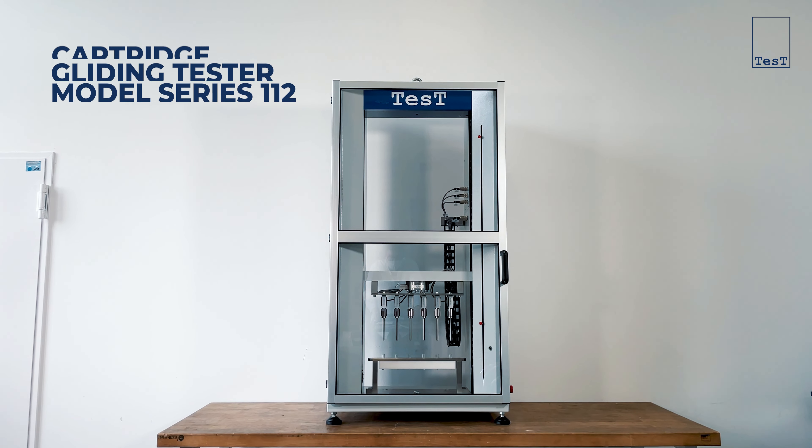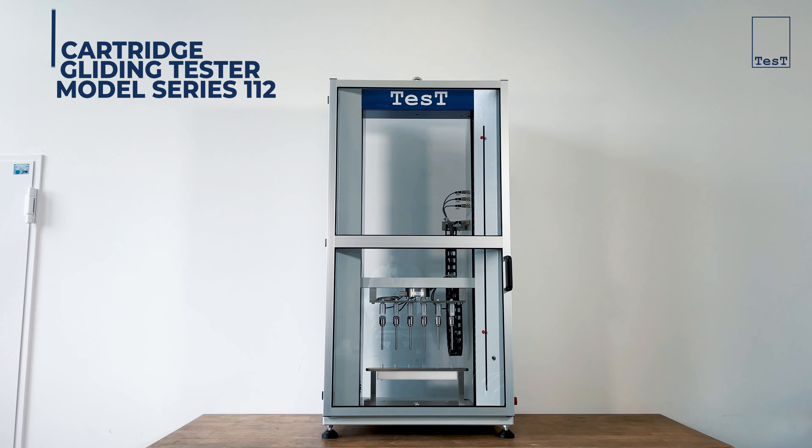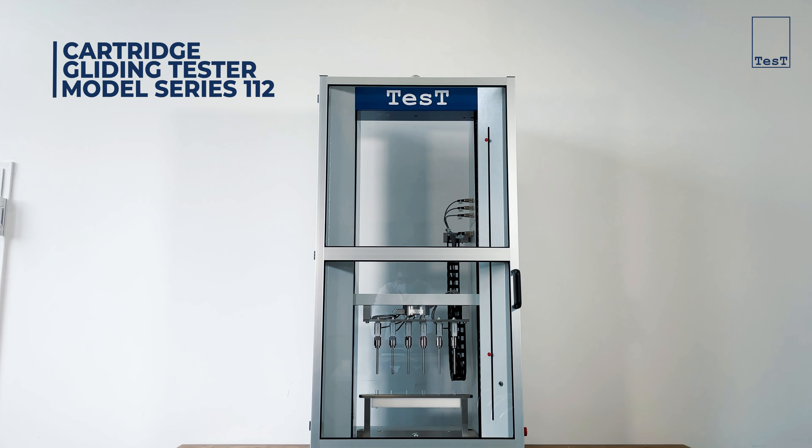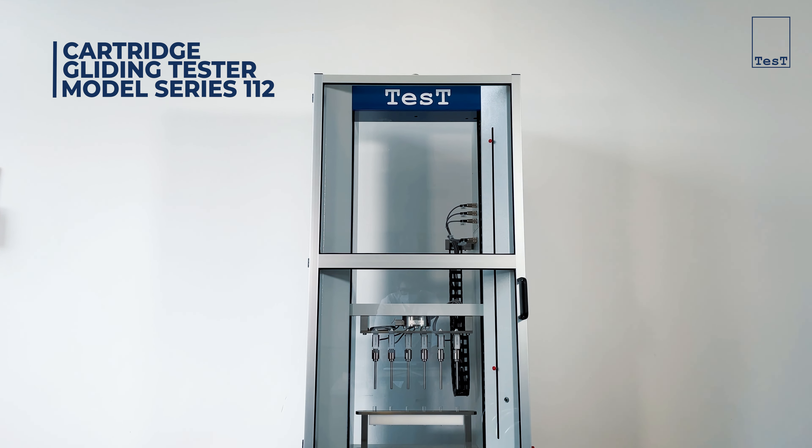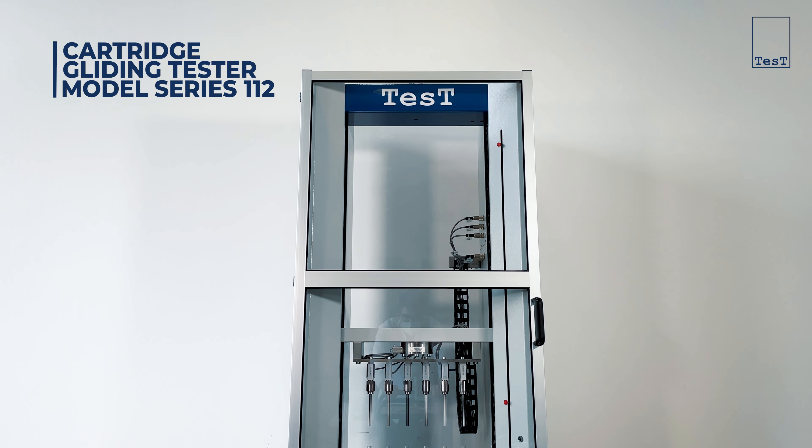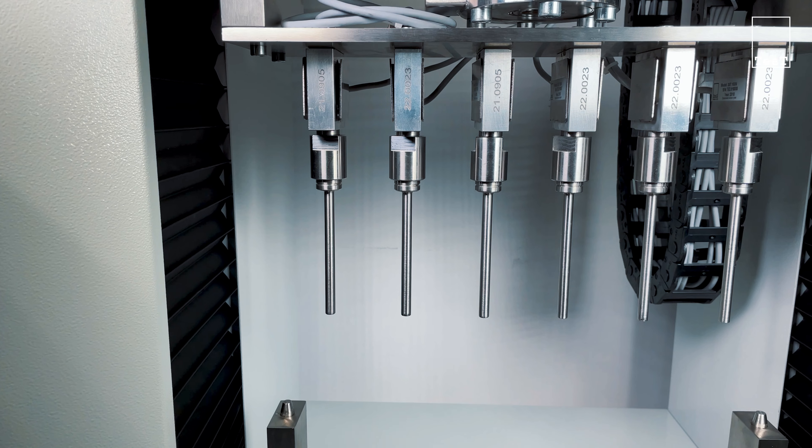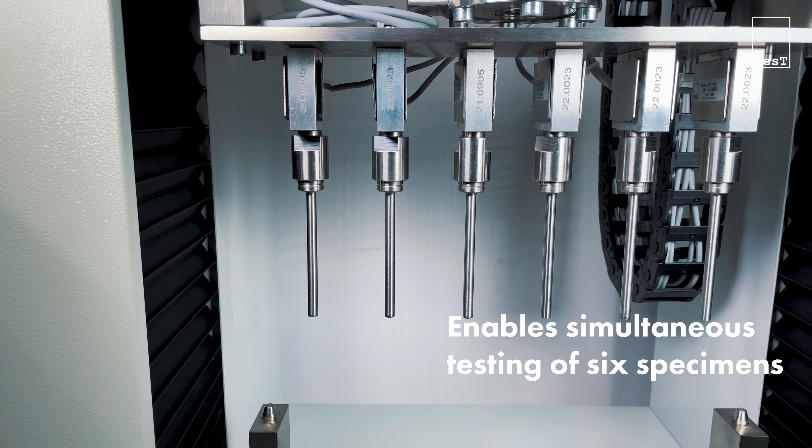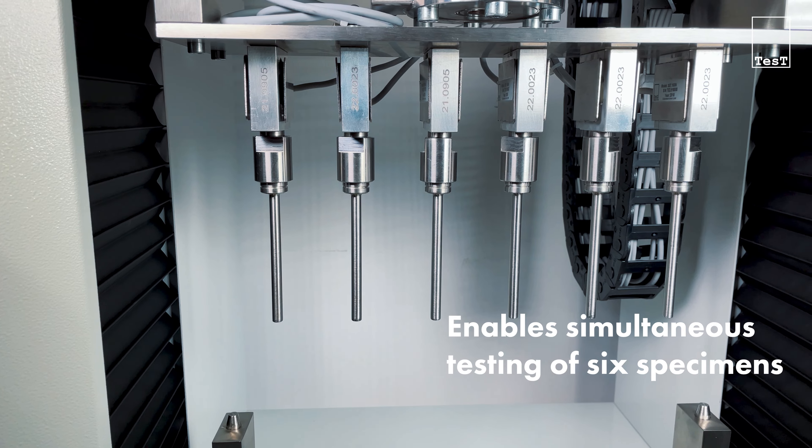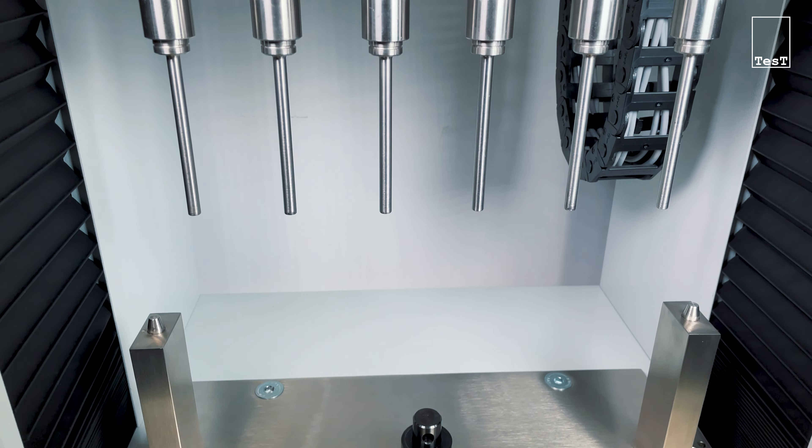With the cartridge gliding tester of the model series 112, TEST offers an elaborate way of testing medical cartridges and syringes, which enables the simultaneous testing of up to six specimens.